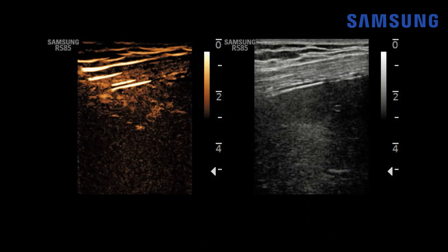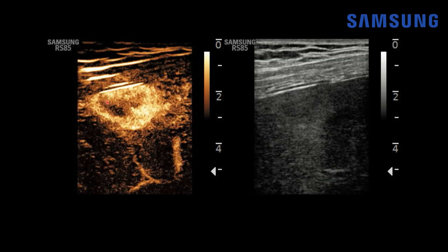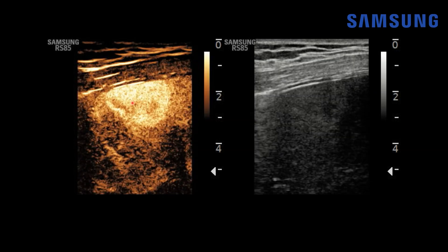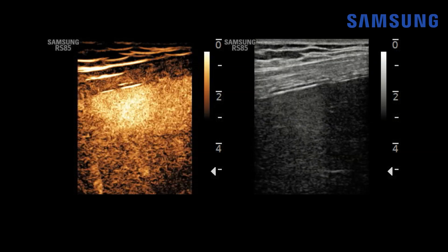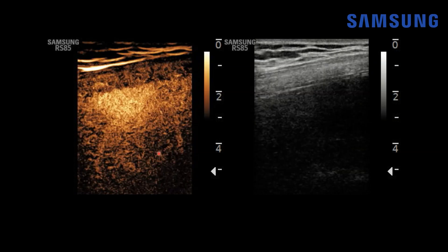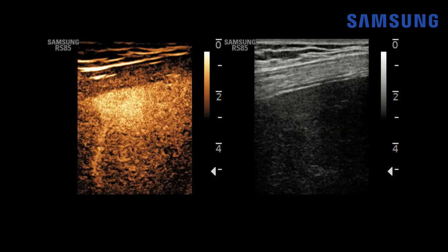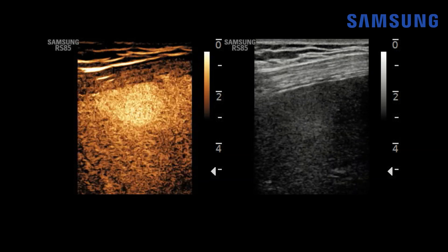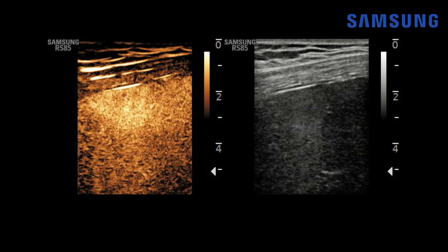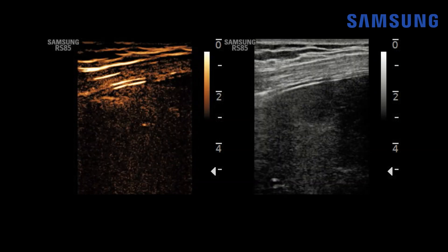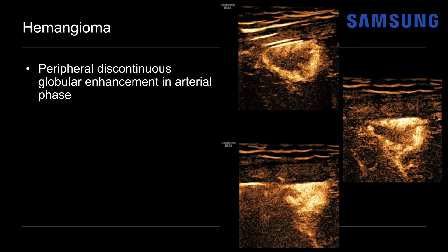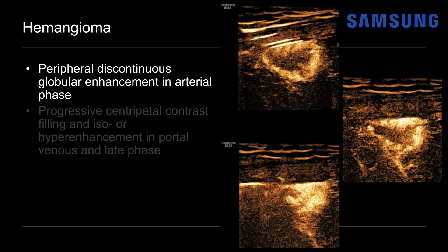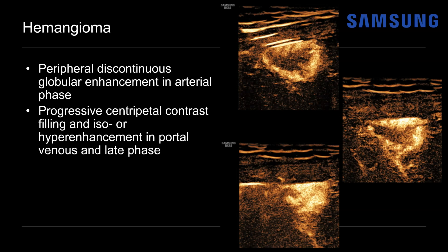On real-time imaging, shortly after contrast administration we see peripheral nodular globular enhancement with gradual centripetal progression. By about 25 to 30 seconds, the lesion is nearly completely filled in and remains hyper-enhancing relative to the surrounding hepatic parenchyma with no washout. This is a typical hepatic hemangioma on contrast ultrasound: peripheral discontinuous globular enhancement in the arterial phase, then progressive centripetal contrast filling with iso- or hyper-enhancement in the portal venous and late equilibrium phases.